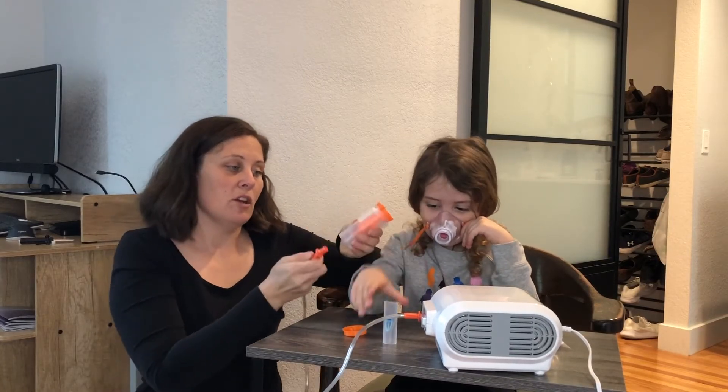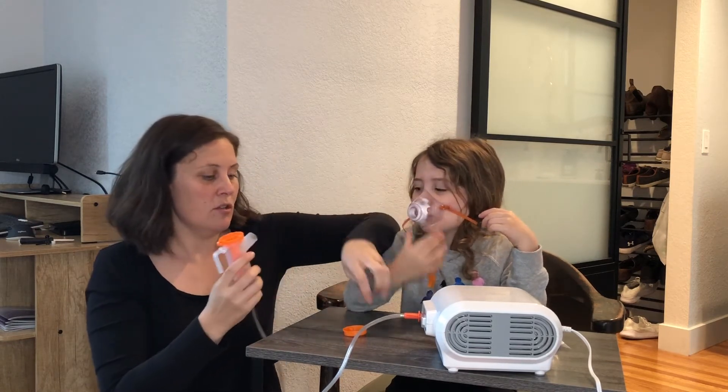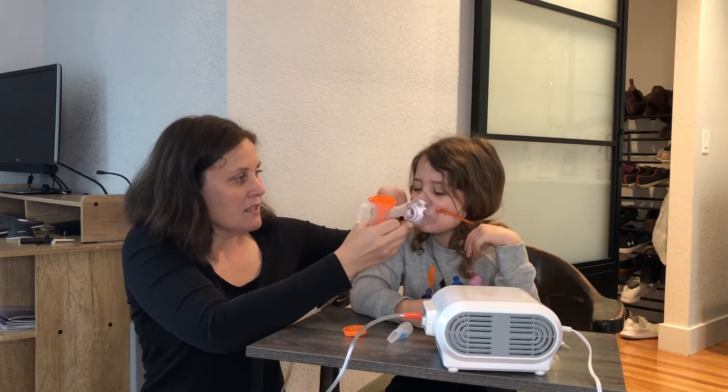This is where you're going to put your medication in, obviously just following your doctor's orders. And then we are going to connect this part right here to the mask.